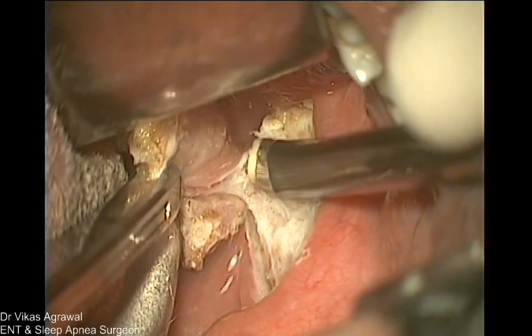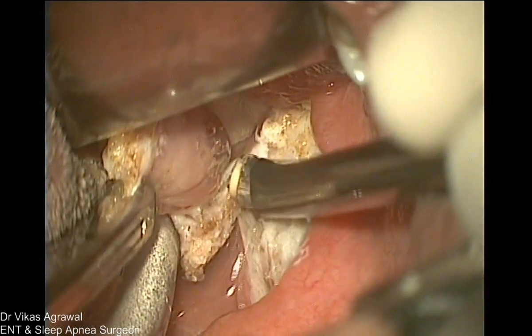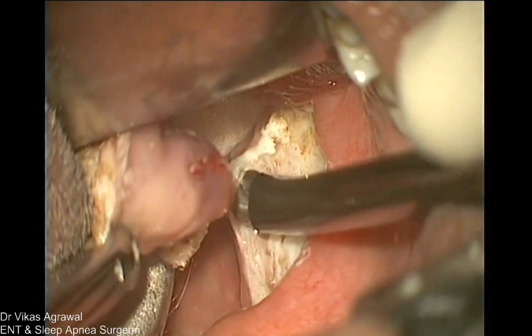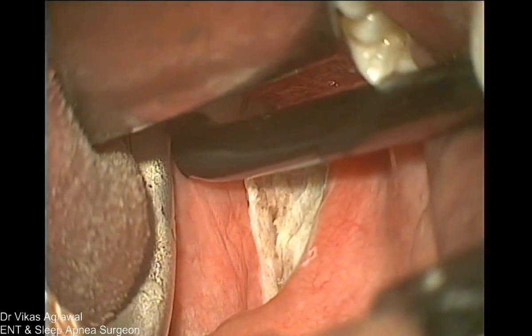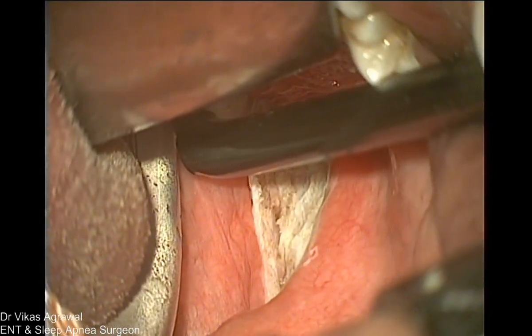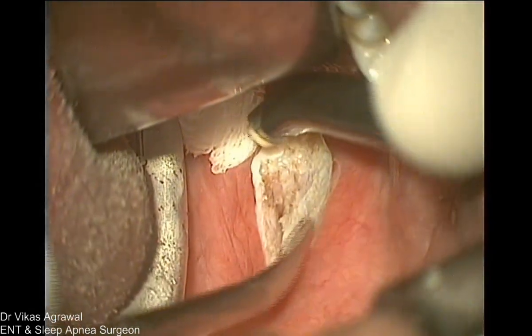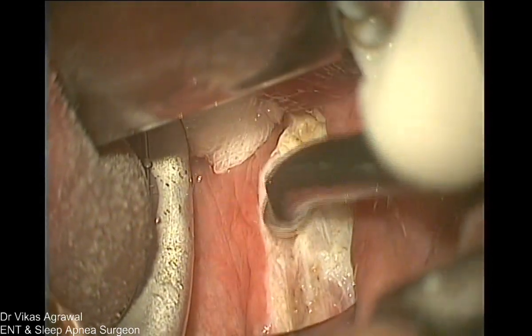Okay. And then it will not have sufficient pressure to cause a secondary bleeding which has to be tackled in the theatre. Right. So our surgery is over. Fantastic. So no suturing for the palate? No suturing. Okay. Kalpesh, approximately how much time we took for the surgery? 30 minutes? So 30 minutes we took for the surgery.